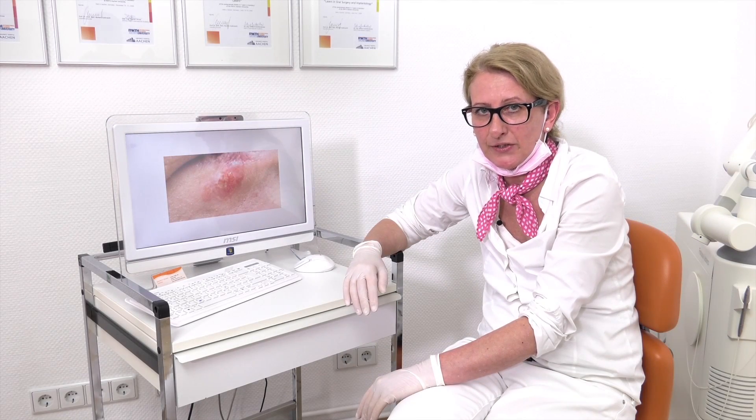Therefore, we fixed up very good pictures so you can see the herpes infection before treating and afterwards. Between the pictures are about 24 hours. So, just have a look. We will look at some pictures where I will show you the herpes infection before treating and afterwards.